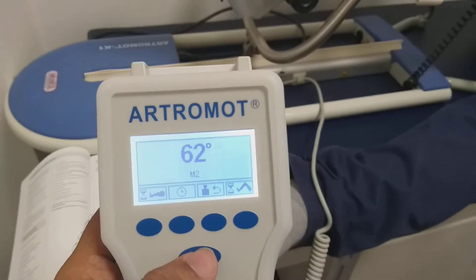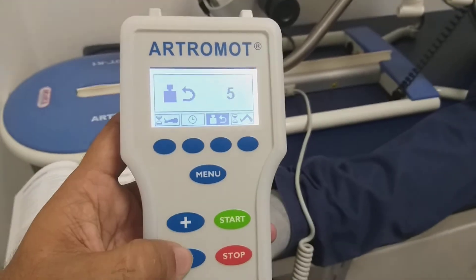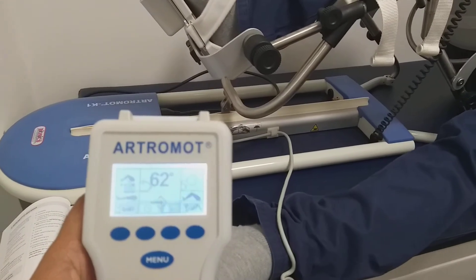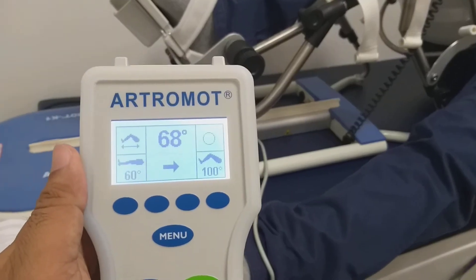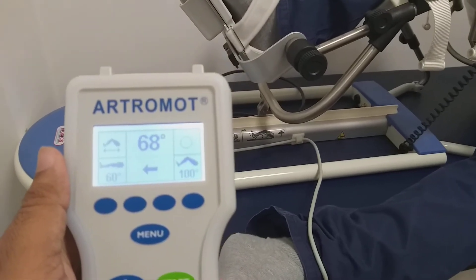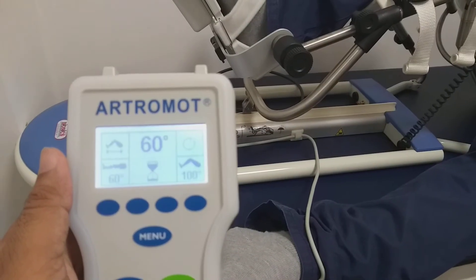Now we can see the reverse load. This is a safety feature for the patient — you press this and you can change the weight from 5 kg to 25 kg as per the patient. If I set 5 kg and start the treatment, the angle increases up to 100 degrees, but once the patient resists at 72 degrees it automatically goes in reverse. After 72 degrees the patient introduced some resistance, so it reverses automatically.